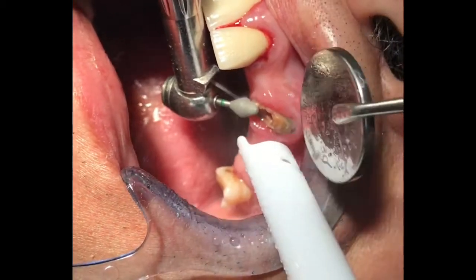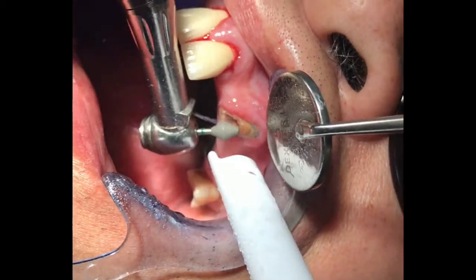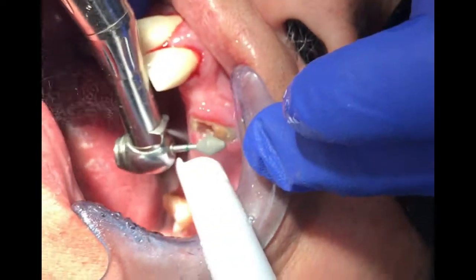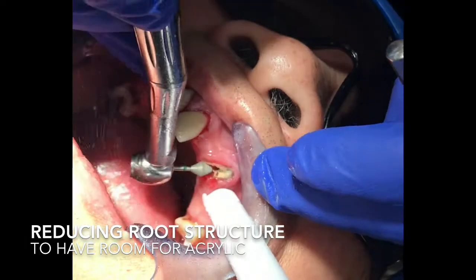What I'm doing right now is reducing tooth number 11 subgingivally 2–3 mm deep, creating some room for the acrylic reline material.